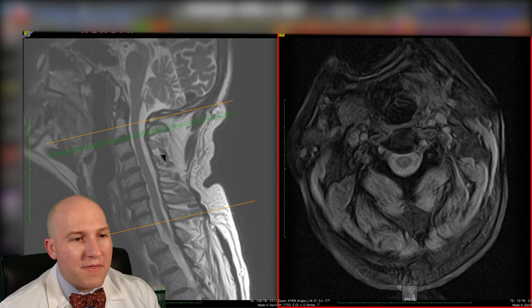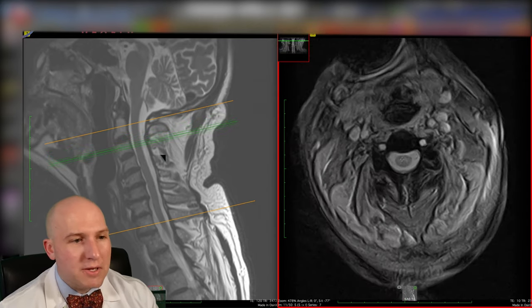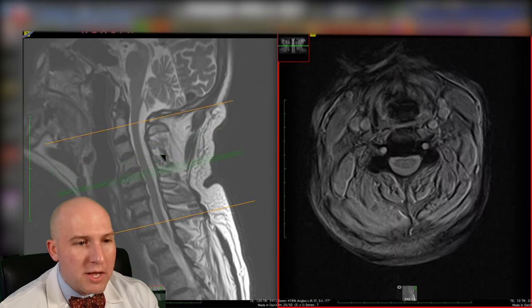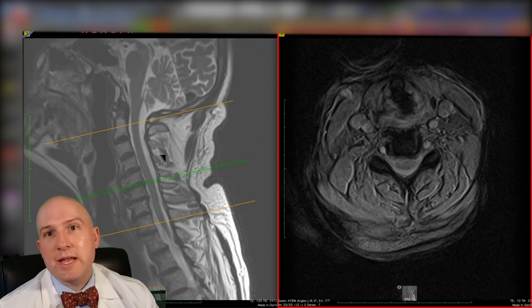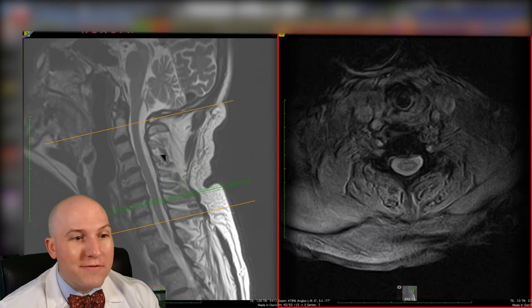As we scroll through on the axial, the spinal cord is sort of kidney bean or oval shaped. And so we look to make sure that there's no spinal cord compression and no spinal nerve compression, which are these are the channels. Really off the bat, I would say focus on the spinal cord. This is going to be the most obvious thing. The other things to look at are all of the soft tissue, right?